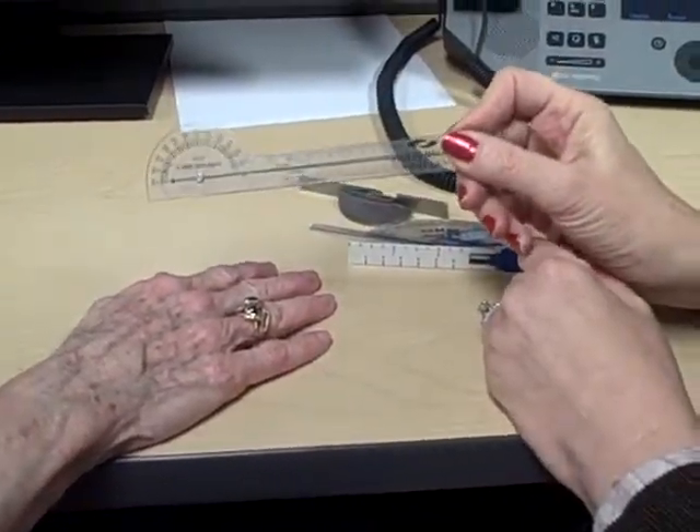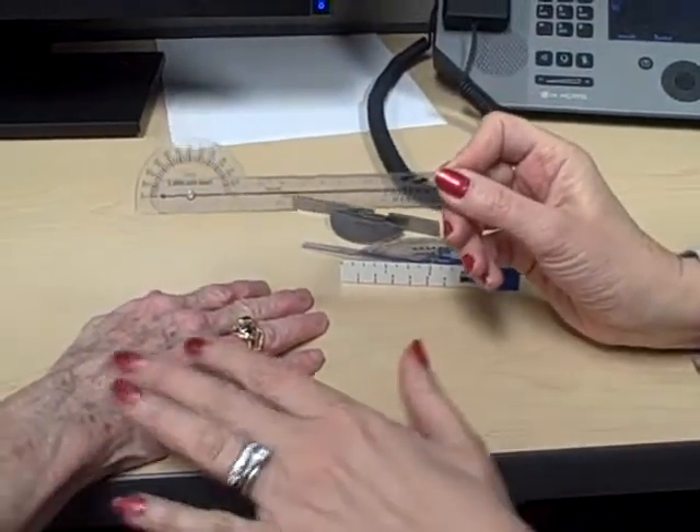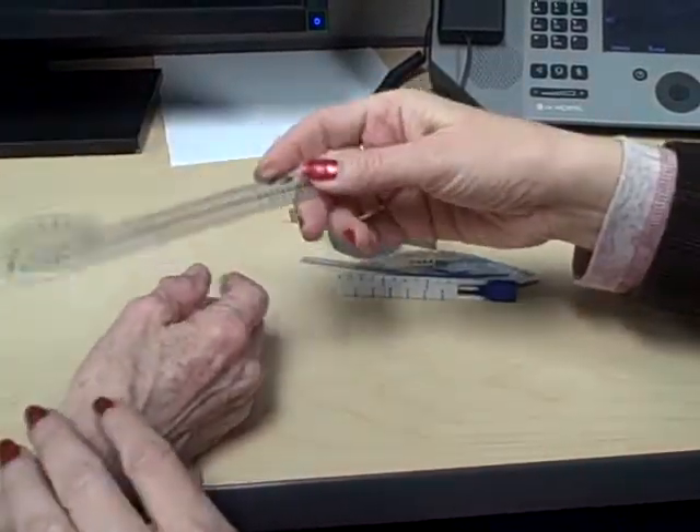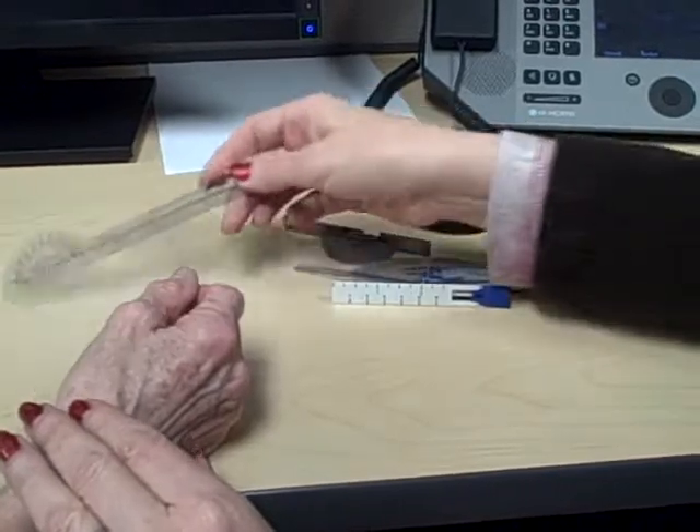This goniometer that we've used for the elbow, forearm, and wrist is really not going to work except for the thumb. We looked at the other video at how you can use this one for the thumb.